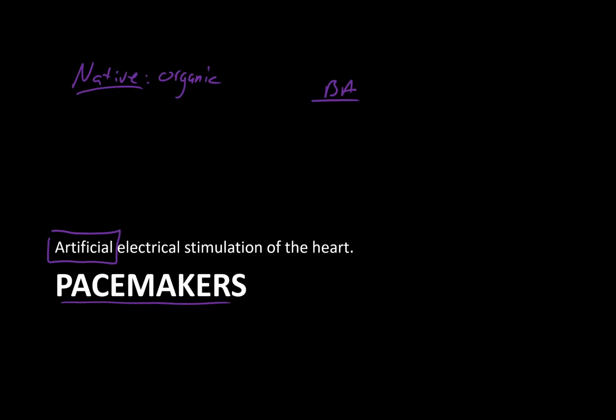the focus I have for you is going to be the terminology and common rhythms. By common rhythms, you can almost think of that as common functions of pacemakers, things like being atrial paced, ventricular paced, AV paced. In some cases, patients have demand pacemakers where their underlying rhythm is okay most of the time, but occasionally that pacemaker needs to kick in to help make up the difference.